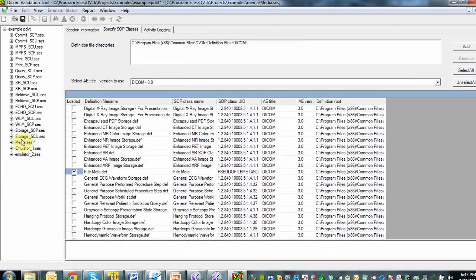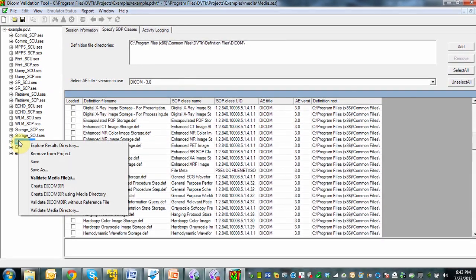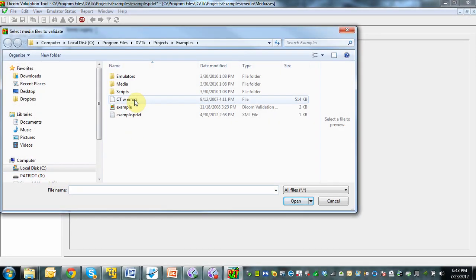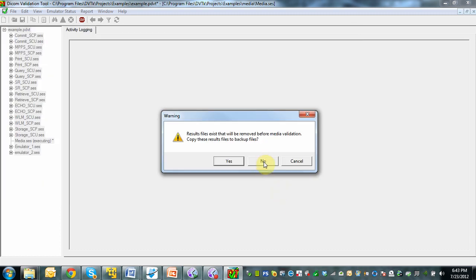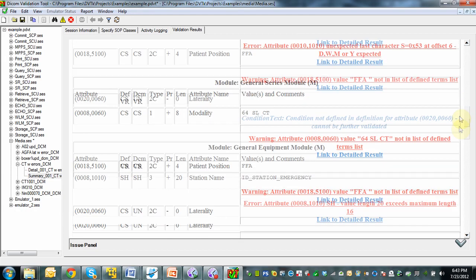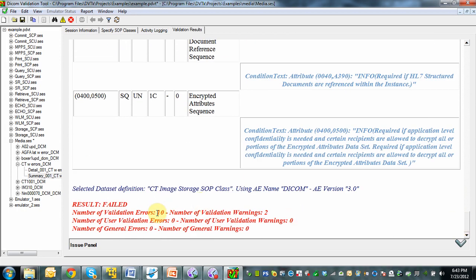Now we're ready to do the validation. We go to Media Session, right-click, and we see a menu come up. We select Validate Media Files and open the particular image that came up with the error in our viewer. We choose not to store results to backup files in this case and select No. We then see the results of the validation. Scrolling down, we see quite a lot of errors — anything in red is an incorrect validation. In this case there were 10 errors and two warnings.